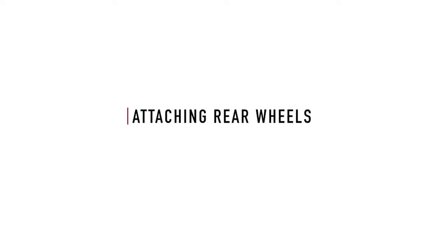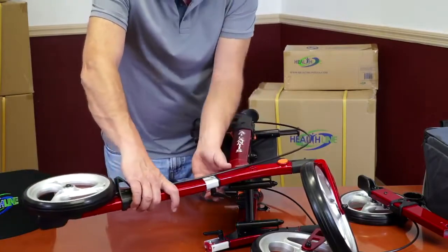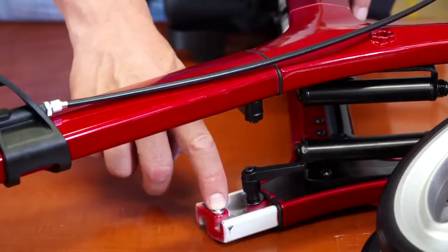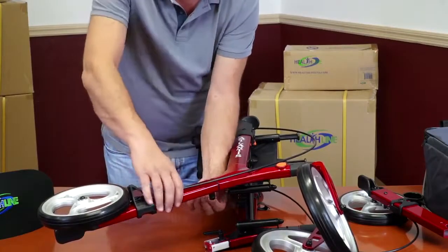Attaching the rear wheels. Align one of the rear legs with the corresponding extension of the main rollator frame and slide it firmly into place until you hear the click of the spring-loaded quick-lock pin. Immediately secure the leg with the plastic knob on the underside of the frame.